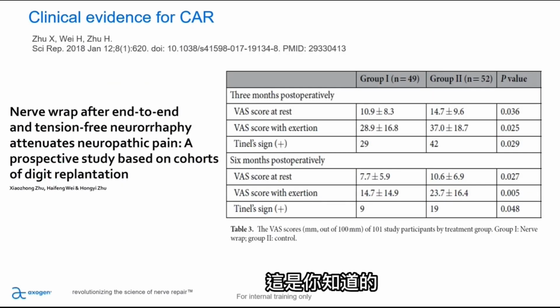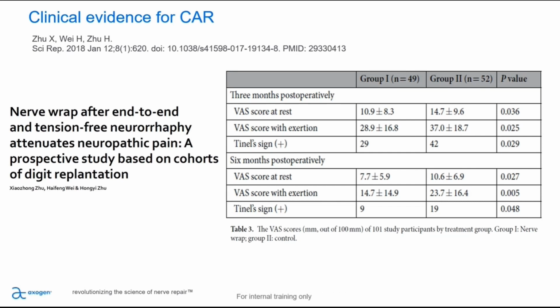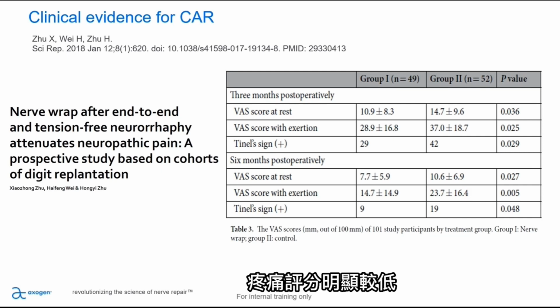This was demonstrated again in another study. In this study, they looked at nerve wrapping to help prevent pain in digital replants. And what they found is that patients who received a wrap at the coaptation during the replant had significantly lower pain scores than patients who did not.